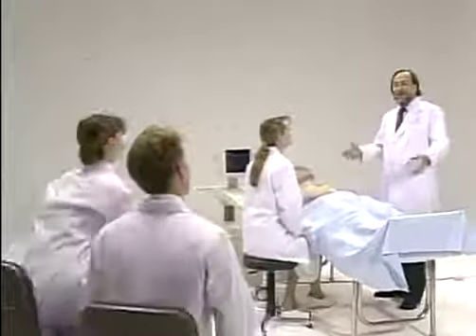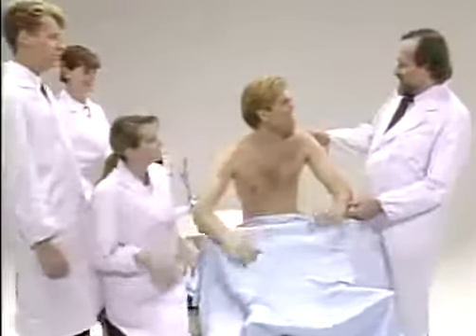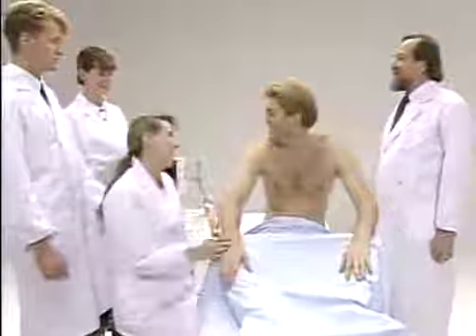Well, the examination is completed. Paul, you can get up off the bed now. Tell me, how's it feel to be a patient? Good. Yeah? Very good. There you go. It's easy, you see.